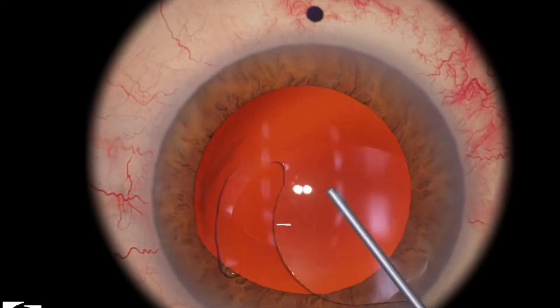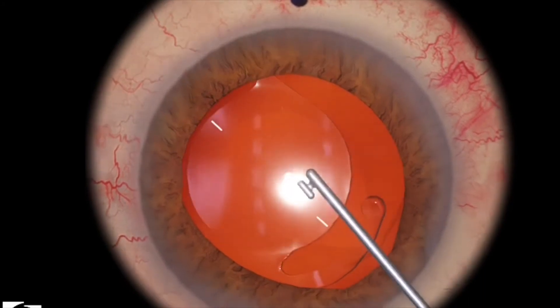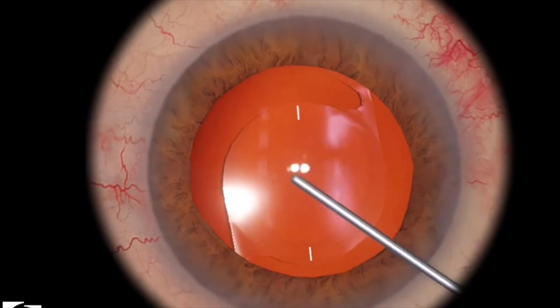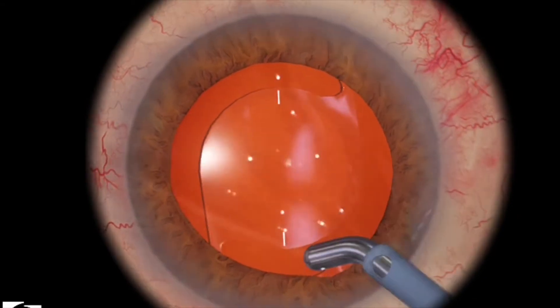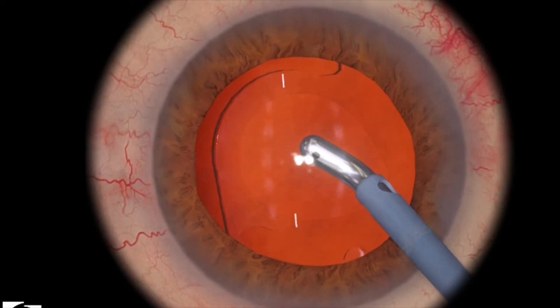In this particular level, the IOL is completely out of place. So you can use any instrument that you want. Just push one haptic back into place, and then push the other haptic back into place. Then you want to realign the toric markers with the markers on the conjunctiva. Then proceed in the regular fashion, just like described in my other videos.